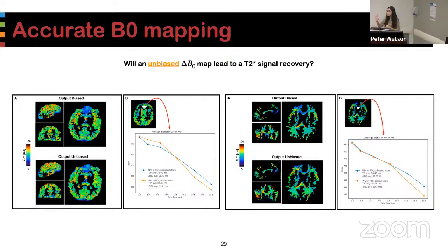So we do see that there is a difference, and the difference is about 10 milliseconds, which in my opinion is significant, because if you measure about a 10 millisecond difference in, say, a healthy or unhealthy tissue, then that's enough for you to say that there's something happening causing that change.